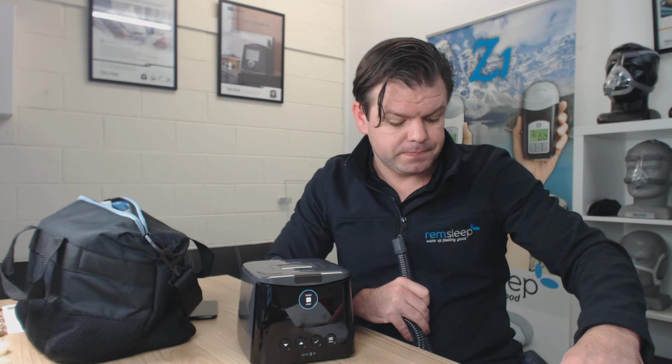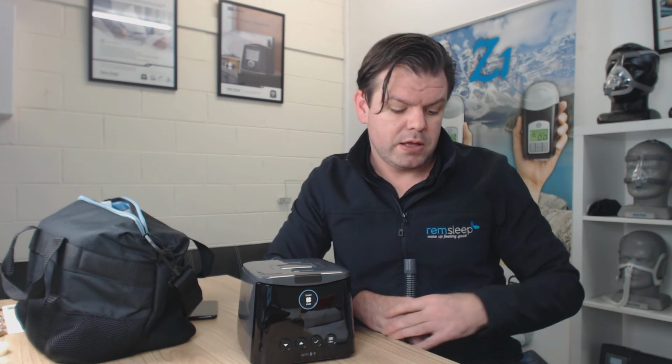What else have I got? I think that's pretty much it. Oh yeah, it also detects central apnea now as well. It never used to be able to detect central apnea. Now it does detect central apnea.